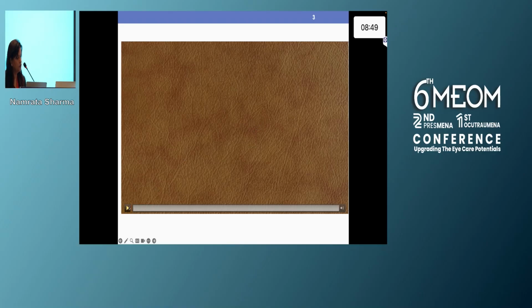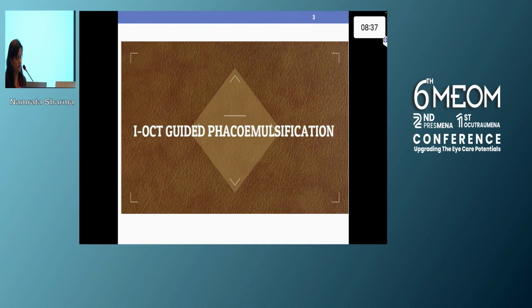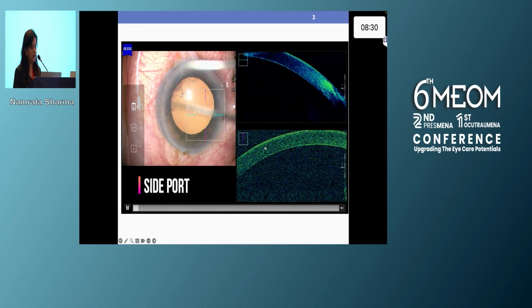We will be going through the videos to see how the intraop OCT microscope helps you to see the unseen. Basically, in the same eyepiece, you have the intraop picture, the surgical field, as well as the intraop OCT microscope, which is actually present at one end. So as you're operating, you can see this also.